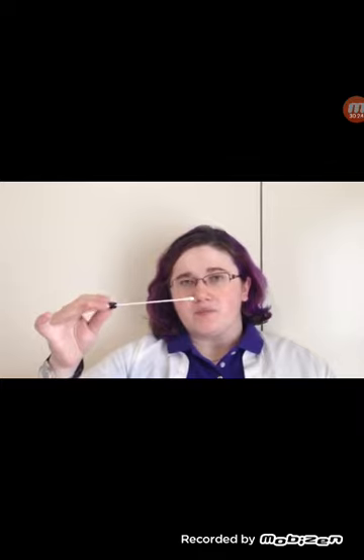There's plenty of buccal cells there that can be collected. And here I'll show you me doing it on myself real quick. Now you should do this for 40 seconds. You can go over but not under. So please time yourself with a watch, your friend, or your phone. And then you just put the swab back in the tube.